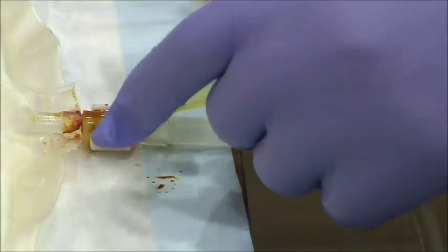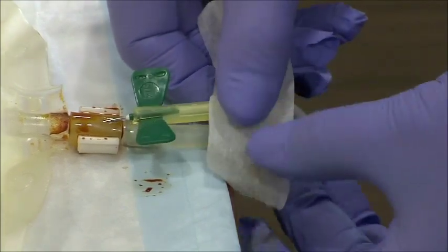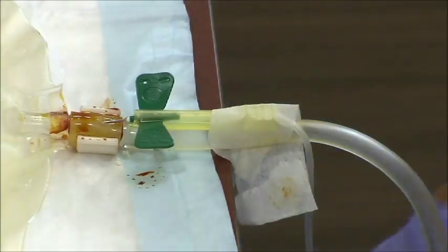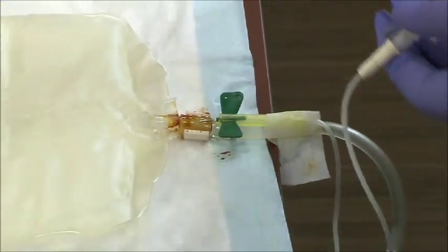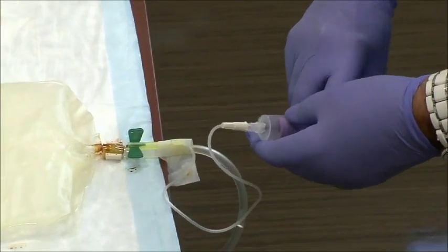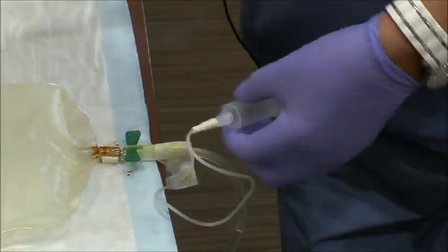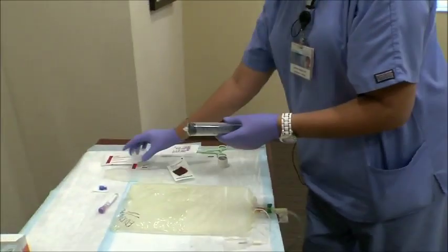So rather than it twisting, I just like to anchor it in place. At this time, we use our lavender tube for the cell count. And we get our 60 cc syringe because we have to draw up 50 cc's.